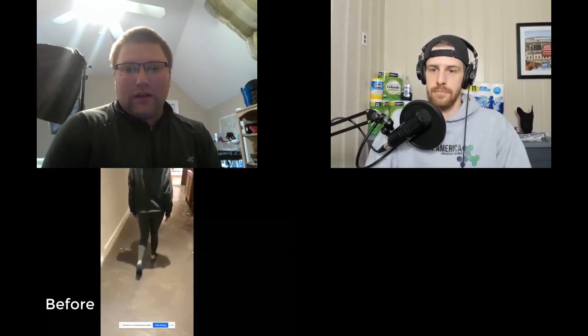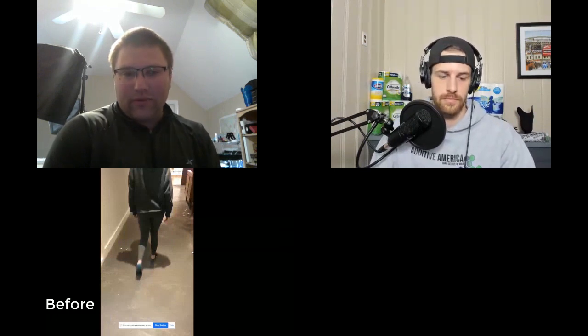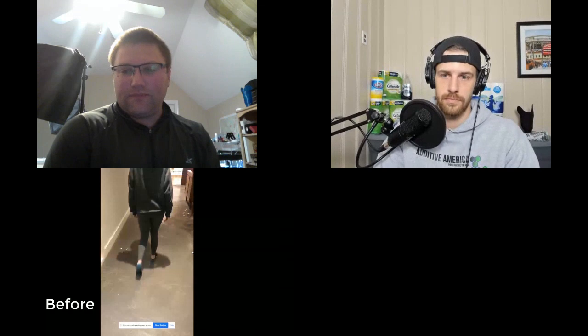So here is a young lady that has an issue with her left leg. Her muscle doesn't actually pull her toes up. So you can see that, and we're going to see a slow motion video here shortly of her. So watch that left leg. It just kind of drops.